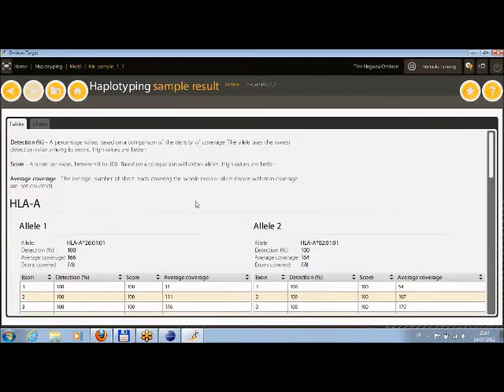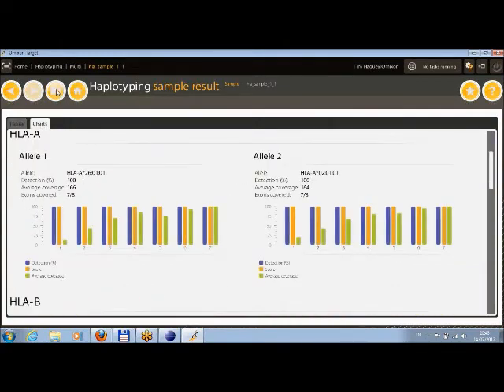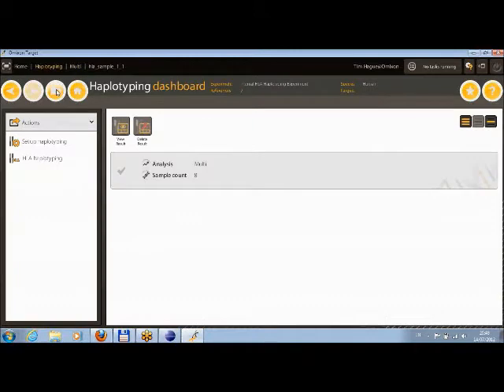You can step in and view some more detail for your result. There's also a chart form of the same thing. I'm not going to show too much about this today, it's just to give you a very brief look at that.